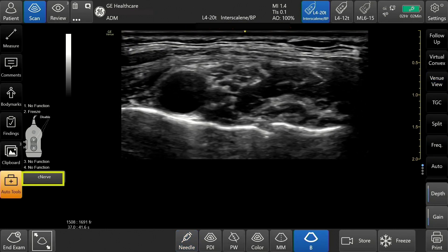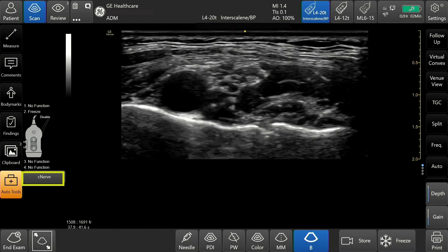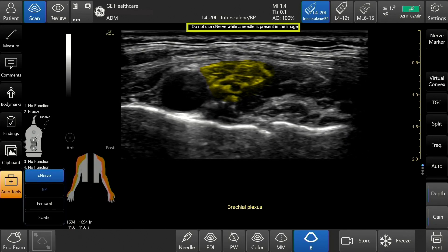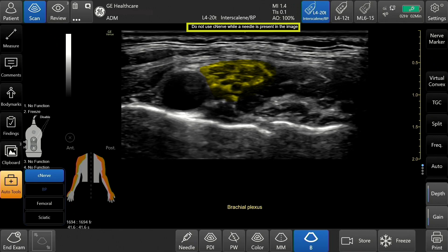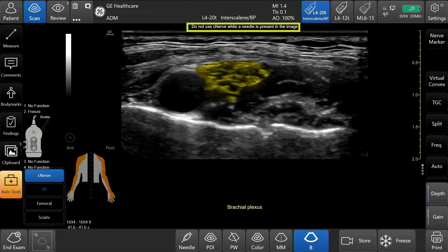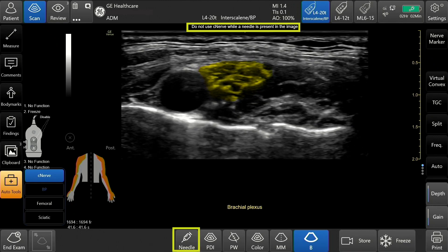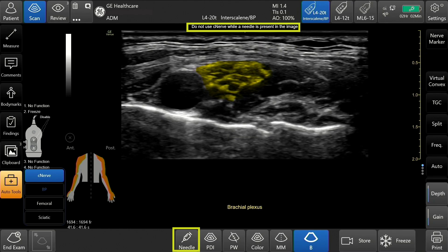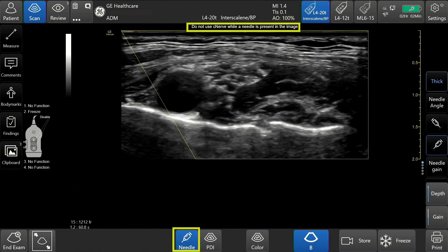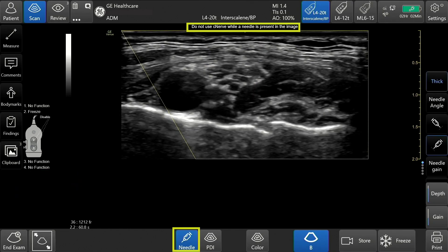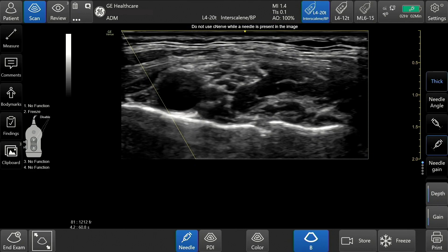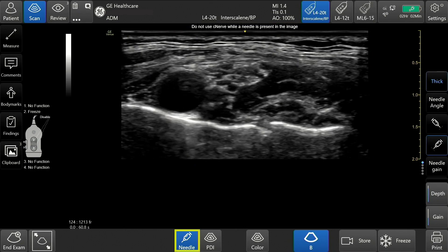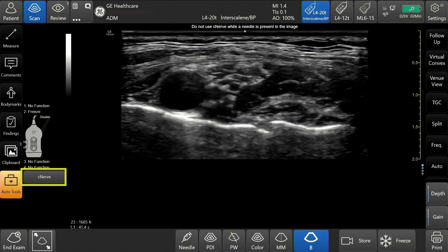Upon tapping C-Nerve, the system will display a message reminding the user not to use C-Nerve while using a needle. If you tap needle mode while in C-Nerve, the system exits C-Nerve and enters needle mode. Exit needle mode to re-enter C-Nerve.